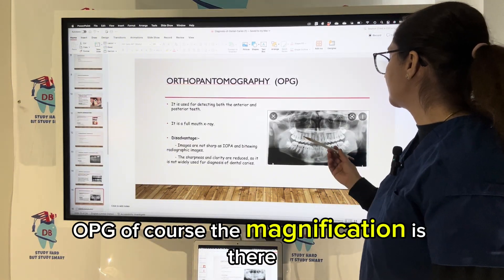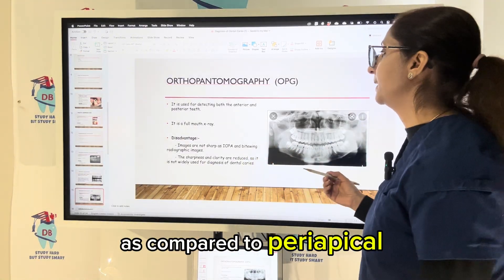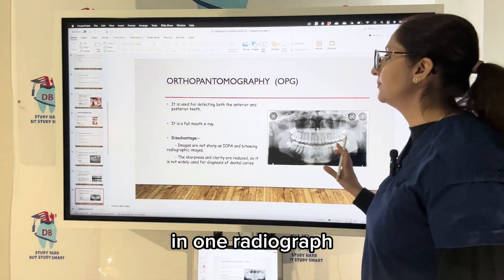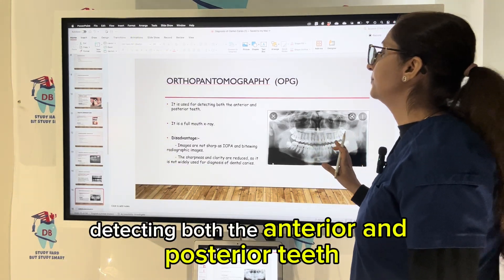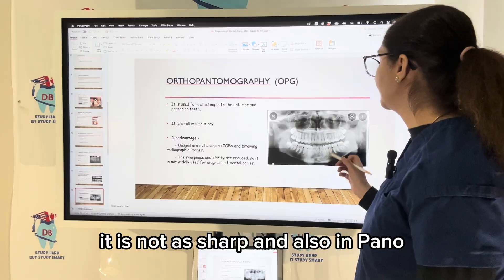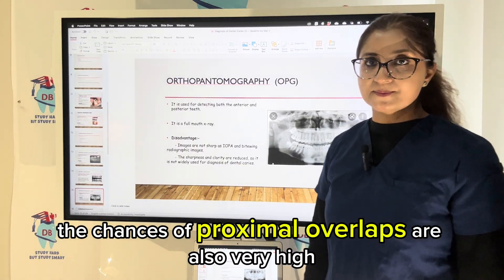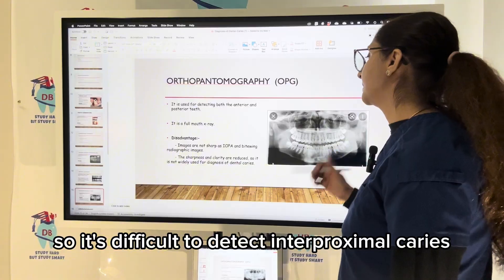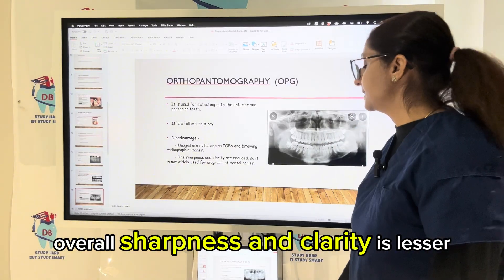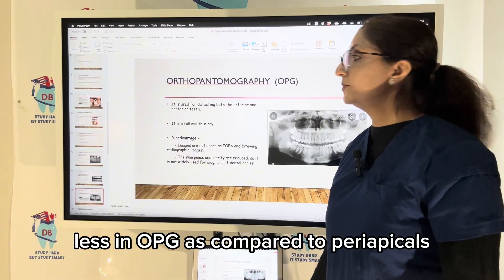With OPG, there is magnification and the resolution is not as sharp as compared to periapical or bite wing radiographs. However, you can see all the teeth together in one radiograph, detecting both anterior and posterior teeth. The disadvantage is that it is not as sharp, and in panoramic radiographs the chances of proximal overlaps are very high, making it difficult to detect interproximal caries. Overall, sharpness and clarity is less in OPG as compared to periapicals.